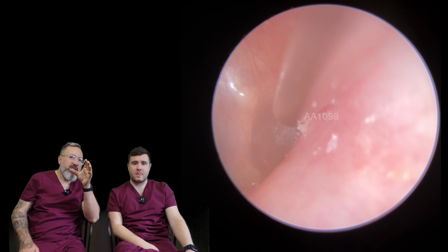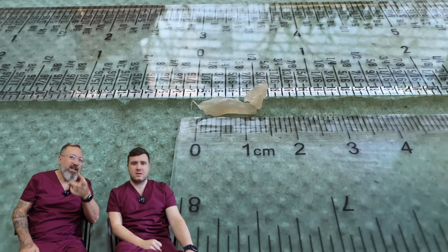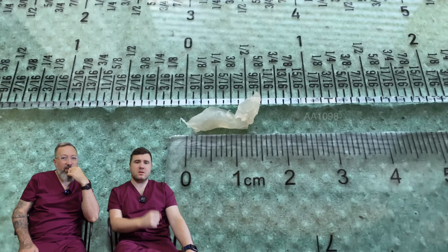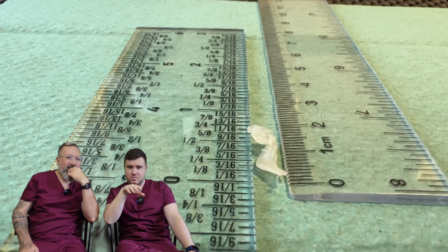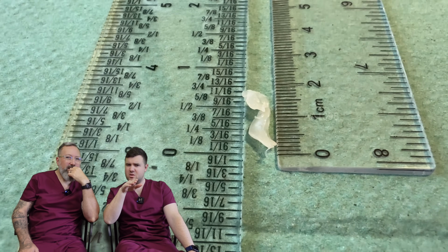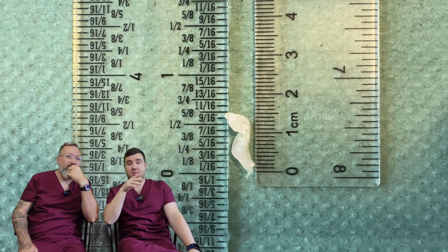It was just a little bit of dry skin, so I just wanted to nip that bit off. But look at that now. You see the difference from the beginning to the end. But that's the silicone plug. 5/8 of an inch, I'm going to go with that one. That's 1.5 centimeters ish, just over. Yeah. Ish. We go with that. Oh, is it bang on? Look at that. 1.5. Oh, there we are. Yeah, it's a bit folded.